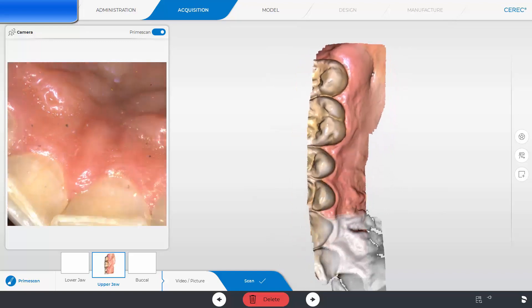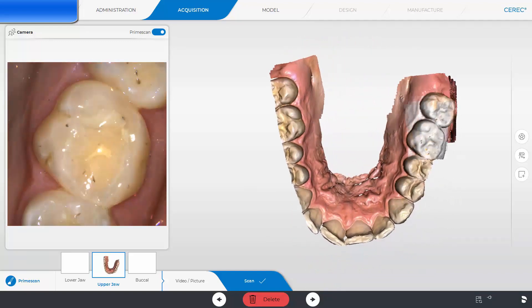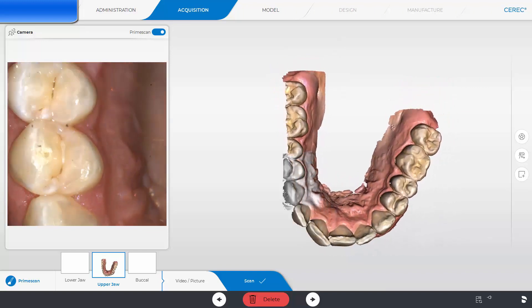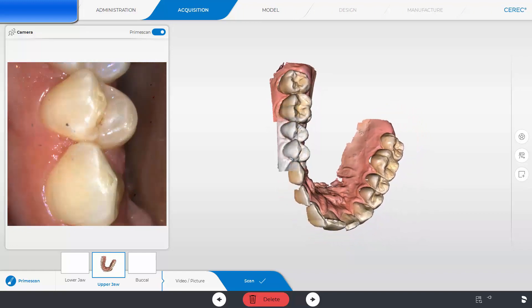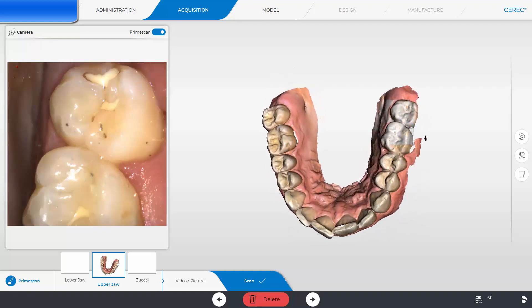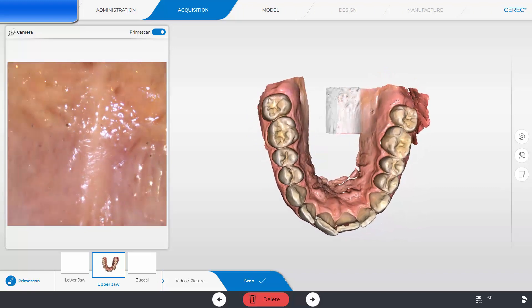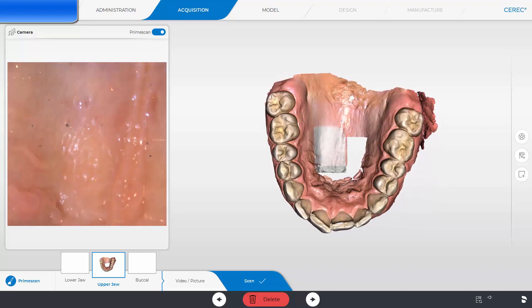Next we are going to look at two full arch scans. The first one has hardly any restorations at all and would be considered an easier scan. The PrimeScan flows quite smoothly along the arch and its large field of view captures most all of the data with the initial scan sweeps. It also scans the soft tissue quite easily and allows you to capture the palate as needed. This real-life scan took 30 seconds.